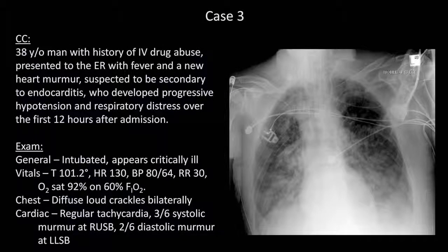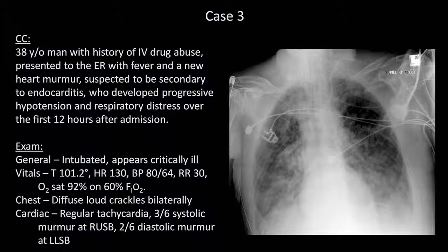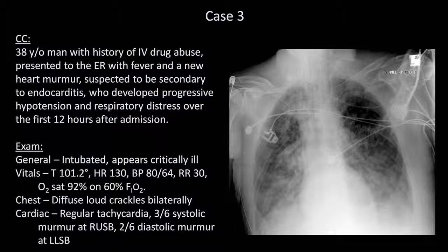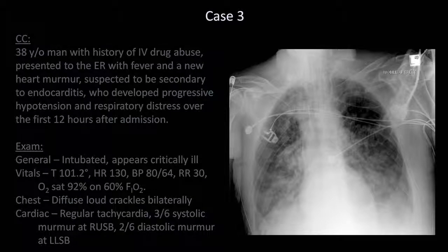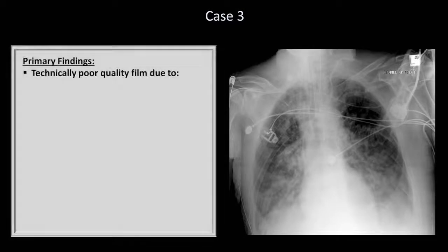Case 3. A 38-year-old man with IV drug abuse presents to the ER with fever and a new heart murmur, suspected to be secondary to endocarditis, who developed progressive hypotension and respiratory distress over the first 12 hours after admission. Before talking about the findings, let's discuss the technical quality of the film, as it's obviously worse than the first two cases. First of all, the patient is rotated, not just around one axis, but around two.